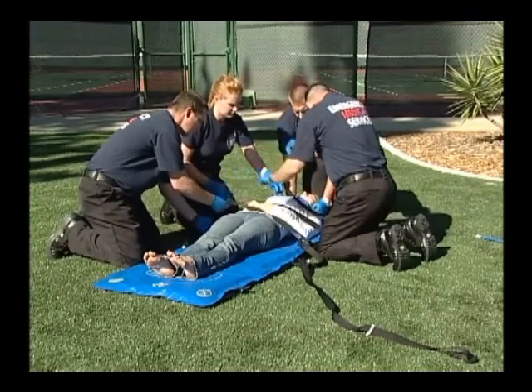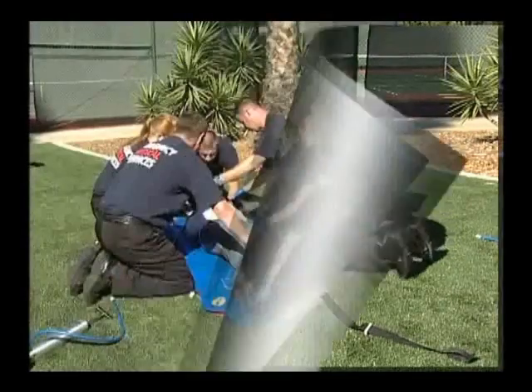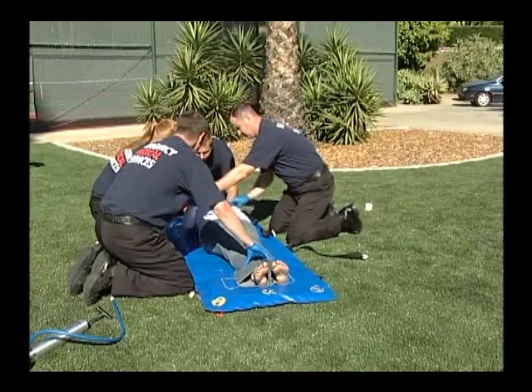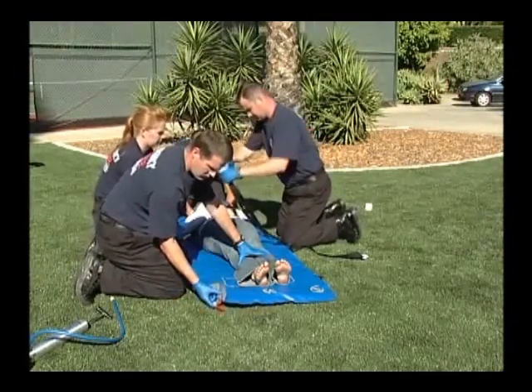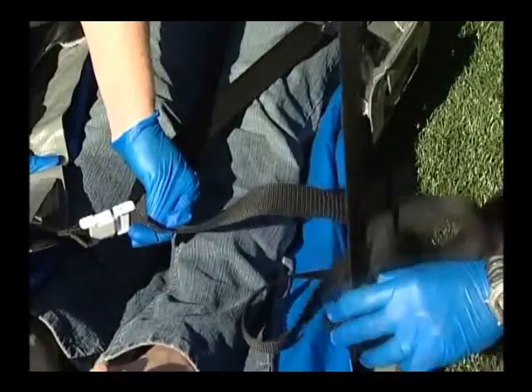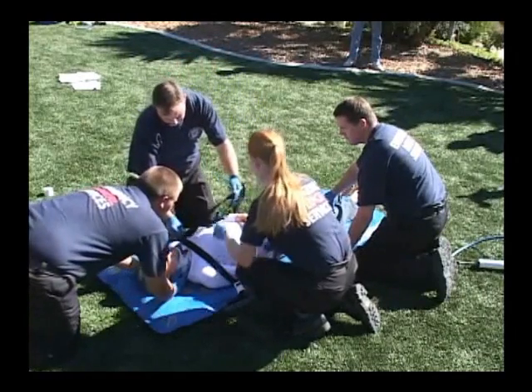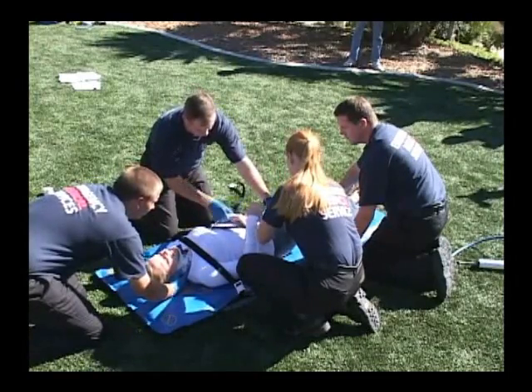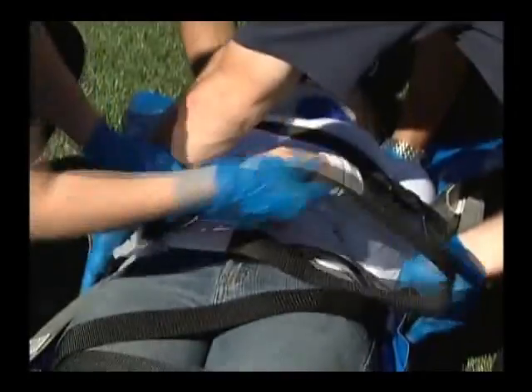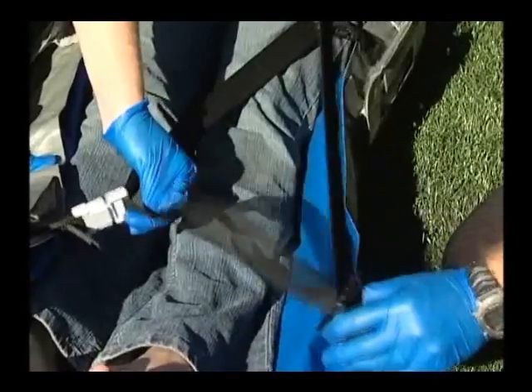Attach the patient restraint strap. Keep in mind that one of the primary functions of the strap is to bring the sides of the mattress up around the patient's body. Method one: start at the chest with the first buckle and work towards the feet. In a zig-zag pattern, attach the black buckles and the white buckles in an alternating fashion. Finish by attaching the black buckle at the foot end. Alternative method: attach all the black buckles on one side of the patient, then follow by attaching all the white buckles on the other side. Starting at the head end of the mattress, remove slack by lifting at the center of each section of strap that spans the distance between the two buckles. Excess strap is pulled through the black buckle at the foot end of the mattress.